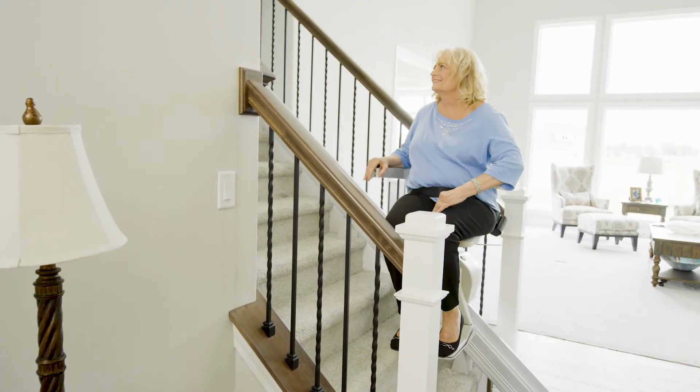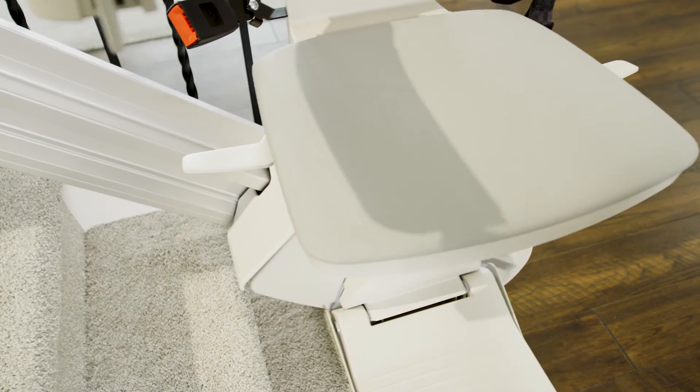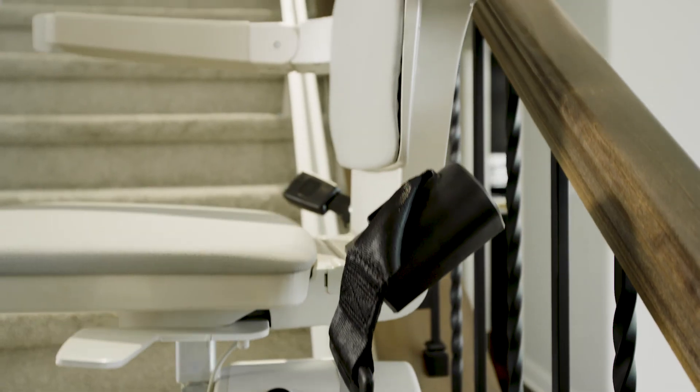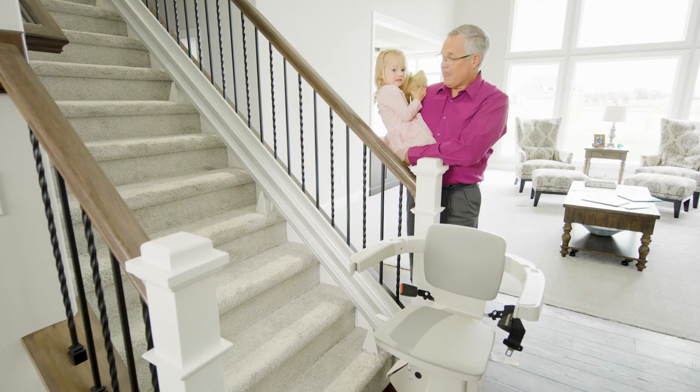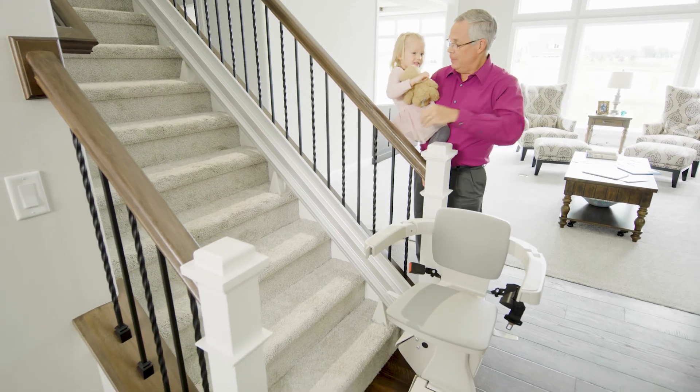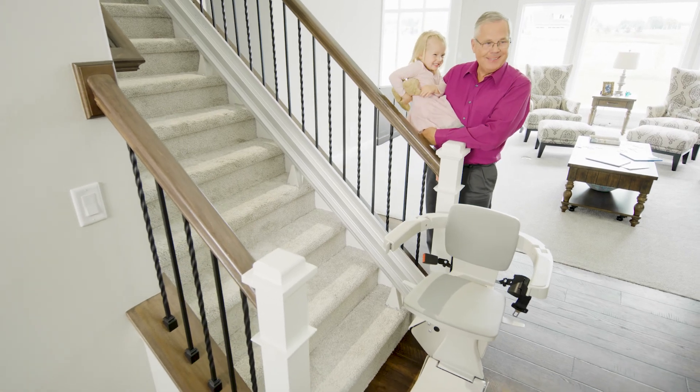In addition to the high quality standard functionality, you can customize the Elan with multiple power options. Ask your authorized Bruno dealer for more details. Home is where the heart is — continue making memories in your home with the Bruno Elan.